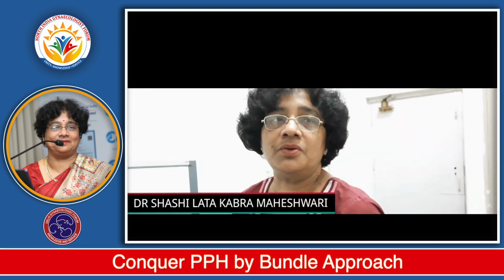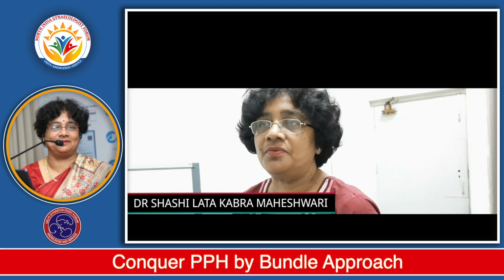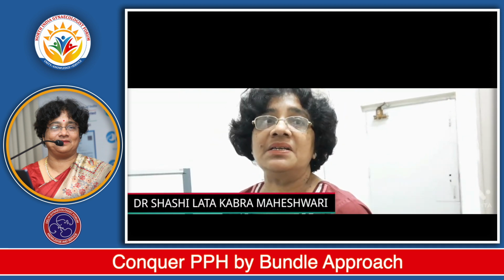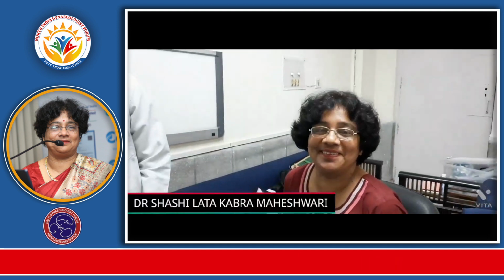So this is how we use Bakri balloon. It is a very good method of prevention of bleeding PV in postpartum hemorrhage in an atonic uterus once the medical management fails and the patient is stable. Thank you.